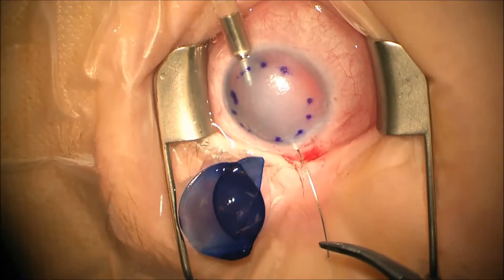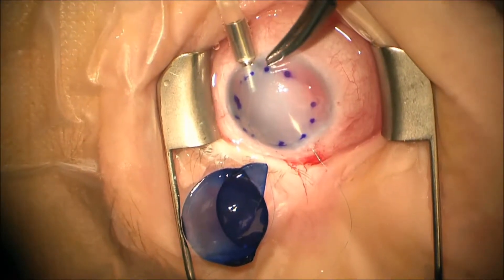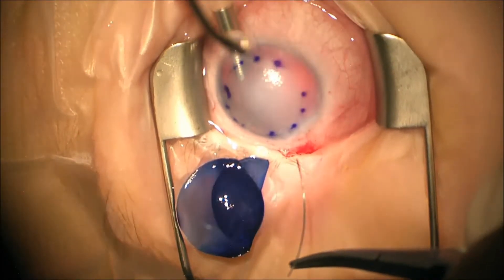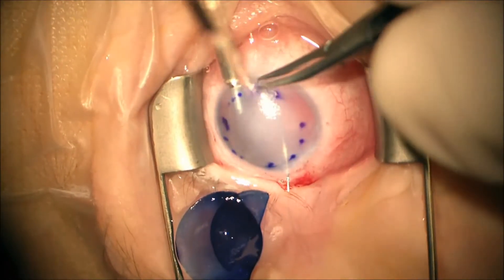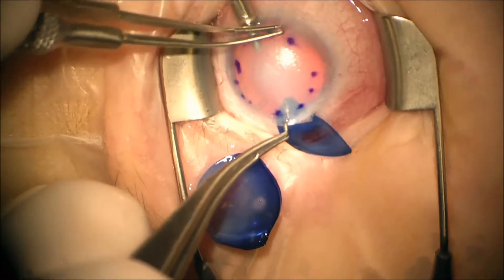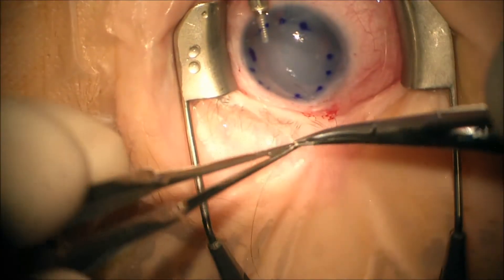Now we're passing the CTC6 needle through our main wound and into the edge of our previously made marking. It's very important to try to keep your orientation correct here because you do not want to crisscross inside the eye. There's our second pass. This is very carefully pulled and this should help put the graft into place. As soon as it gets into place, the flow from the anterior chamber maintainer essentially opens the graft and puts it in its correct orientation.